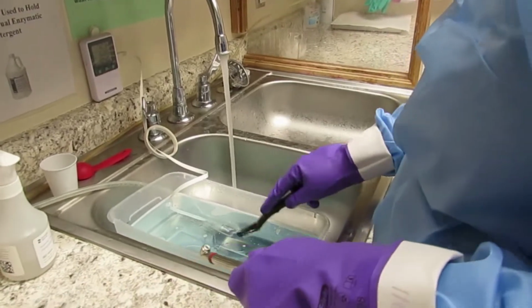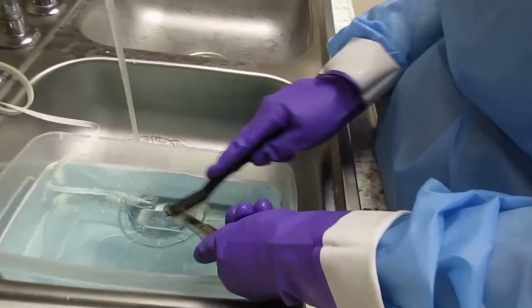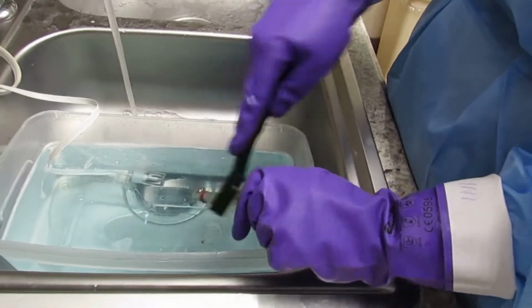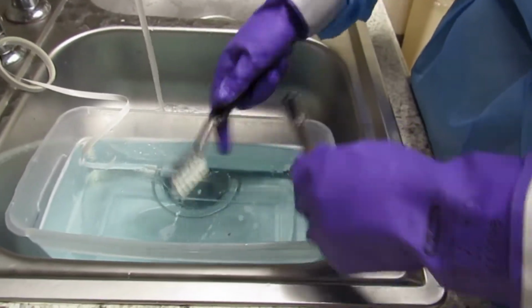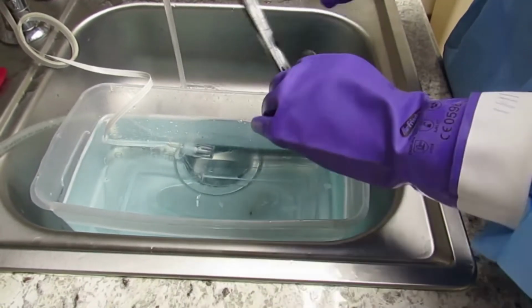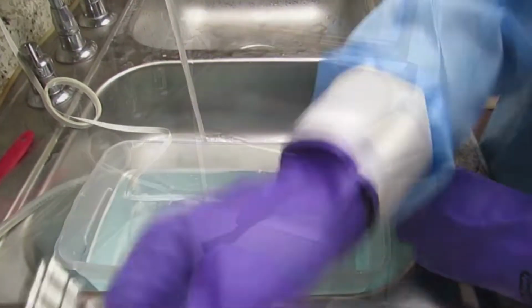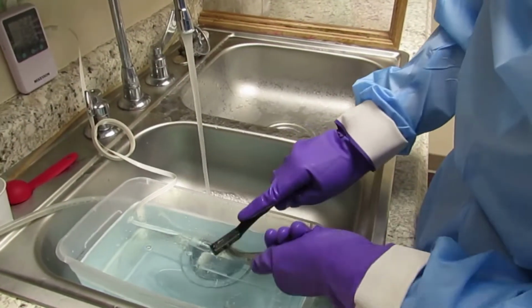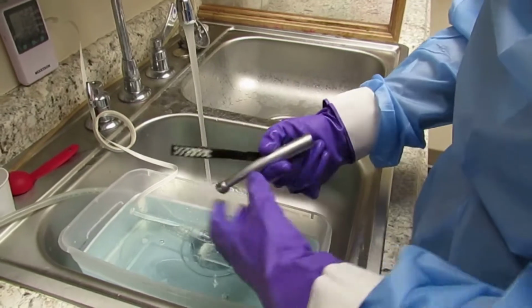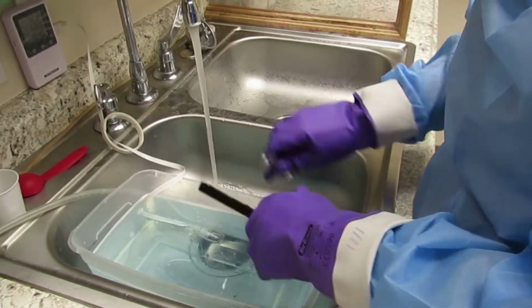Let's begin. We have already created a detergent water bath, which consists of 1 gallon of warm water and 1 ounce of enzymatic detergent. Using a cleaning brush, each handpiece will be scrubbed above water in a downward motion and away from you. Remember, handpieces cannot be submerged in water or any type of chemical.